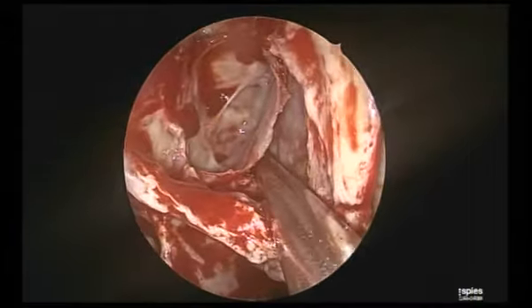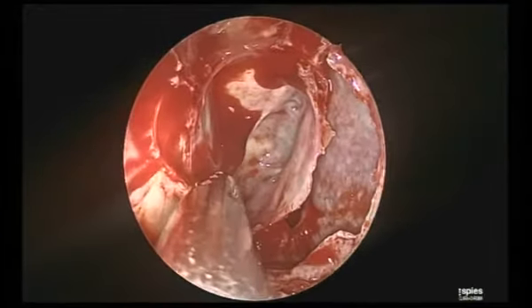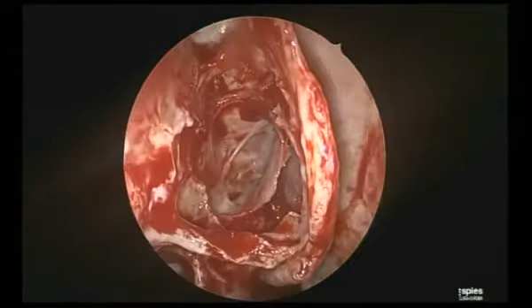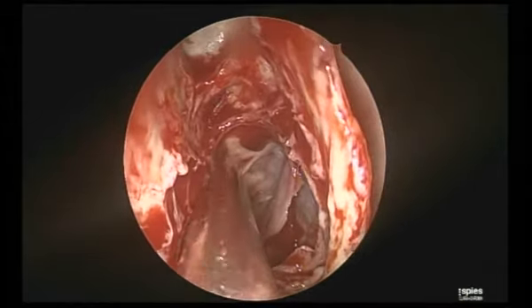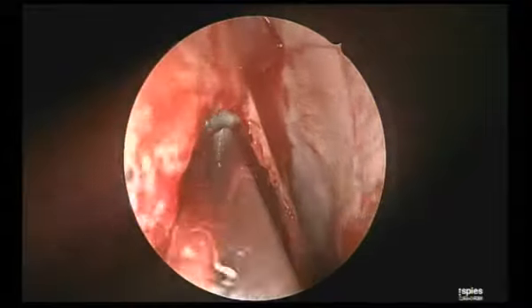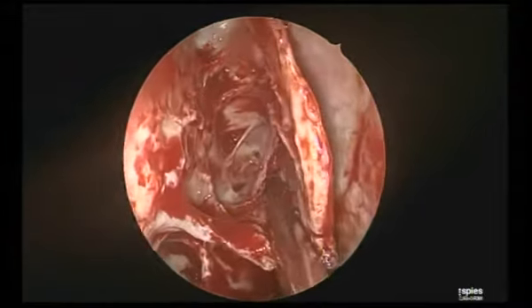Now see why we opted for this technique of going medially and looking for the frontal. This is the sphenoid. I should not cross my limit. See, my limit is here, and see where the Onodi is. If I keep doing posterior ethmoidectomy like this and don't realize I'm in the sphenoid or in an Onodi cell, I can easily hit the optic nerve. That's how Onodi has become so popular, and it is totally taken care of with this technique.